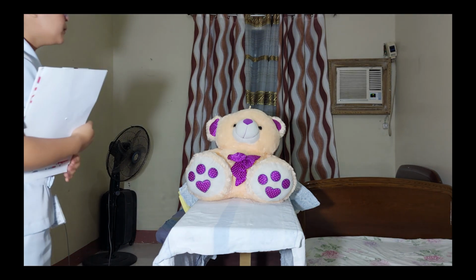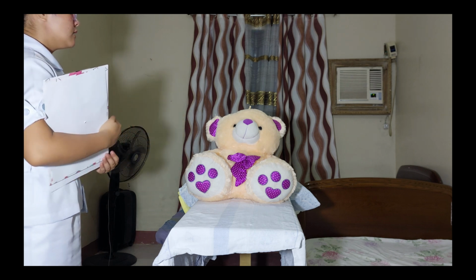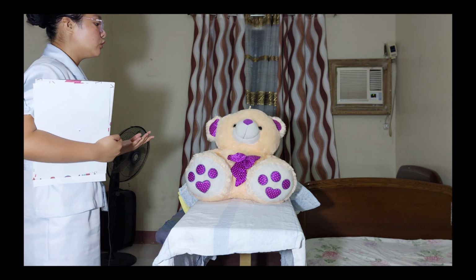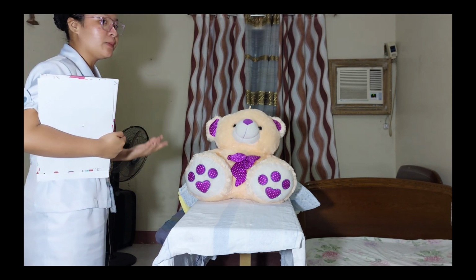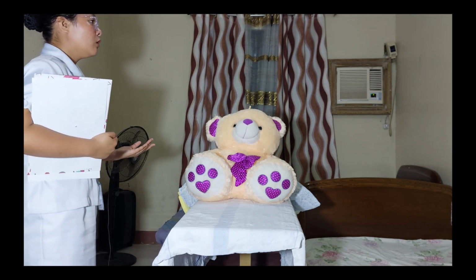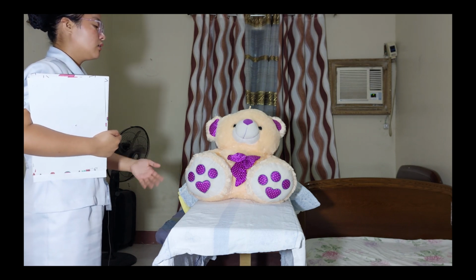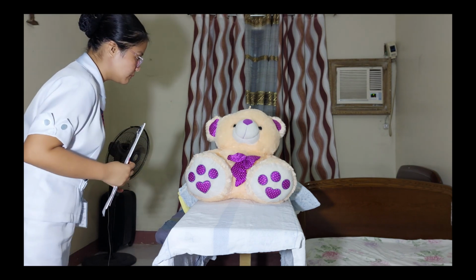Good morning po. My name is Catherine and I am your student nurse for today. Before I start to explain the procedure, may I know your name po and your birthday? This is to identify you po as my client and also to evaluate your consciousness. Okay po, thank you po Ma'am Sofia.